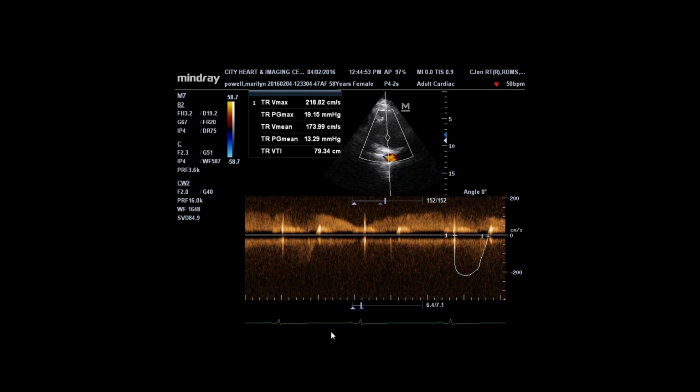Your ECG is on the bottom, and these are artifacts right up there. But if you look here, there's a pattern. You have a flow below the baseline there. There's one there, and another one there. Your transducer is across the tricuspid valve. This is your RV inflow view.